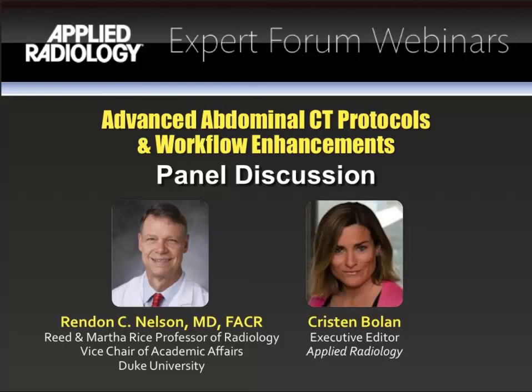And then we gave the saline at a wide variety of different rates compared to the iodine dose, and generally, if you give it at a higher injection rate than the contrast media, then you'll get more enhancement. Like I said, if you go up to 1.5 times, that's a comfortable rate for most individuals. So if you're giving the contrast media at 3 to 4 mLs per second, then I would give the saline at 4.5 to maybe even 6 mLs per second, because it's a lower viscosity. However, what do you get from doing that? If you're imaging only in the venous phase, you really get nothing from doing that, because the effect of giving it quicker is really dampened by imaging in the venous phase.